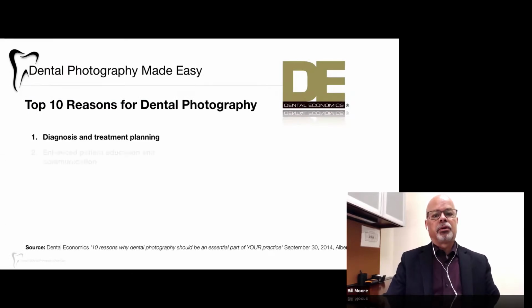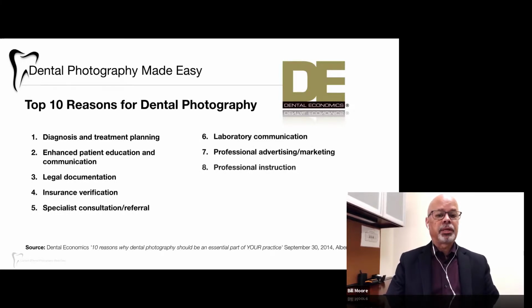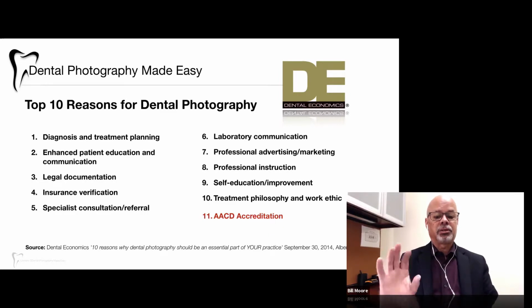What are the reasons for doing dental photography in your practice? Dr. Wilson's alluded to some of them. There's an article in Dental Economics that came out several years ago that has great reasons for doing it. They came out with 10 in this article, and I added one. If you're going for accreditation with the American Academy of Cosmetic Dentistry, then you really need to do dental photography. You have to, because you have to document your cases. So that's an 11th topic, and we can talk about that another time or offline.